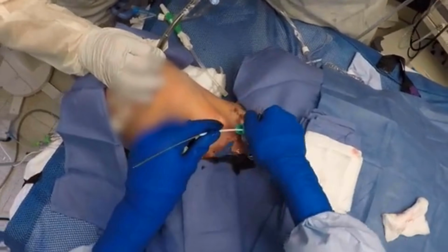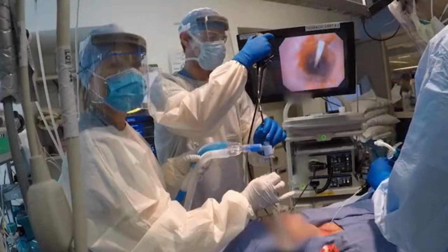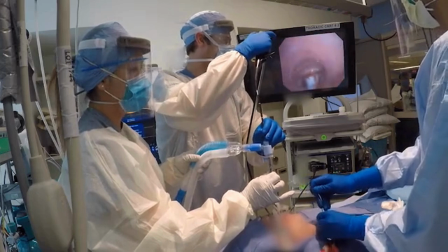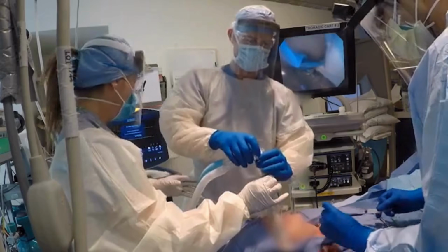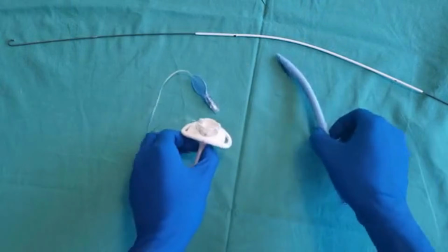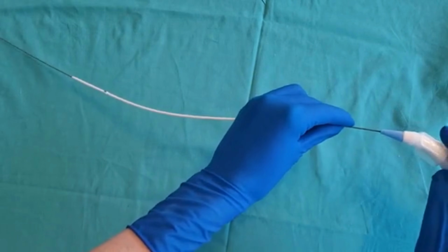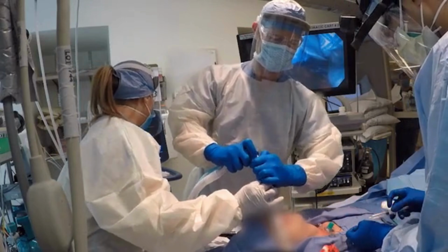Then, insert an appropriately sized tracheostomy tube into the trachea over the wire and sheath. If using a flexible tube, insert it with the curve toward the patient's head. Once you see the tube in the trachea, rotate it 180 degrees to its normal orientation. This prevents pretracheal plane creation. Alternatively, load a non-flexible tube onto an insertion trocar and advance it over the wire and sheath into the trachea. Remove the sheath, wire, and trocar if used.